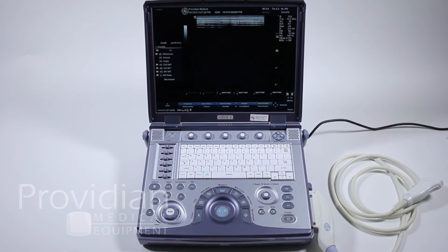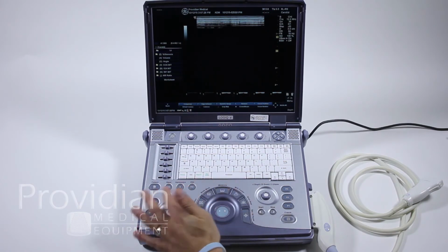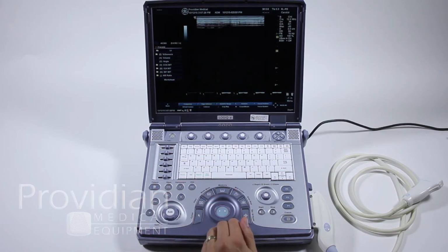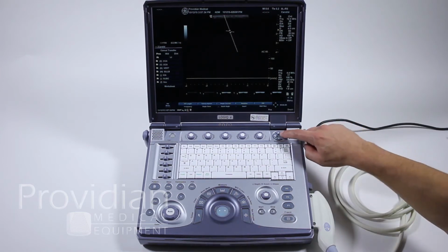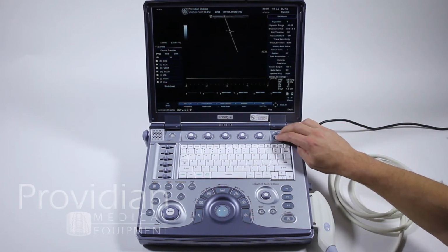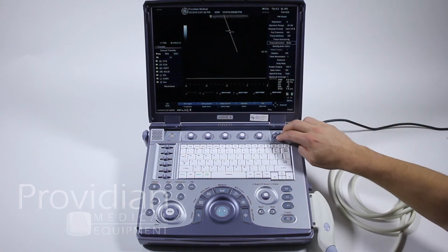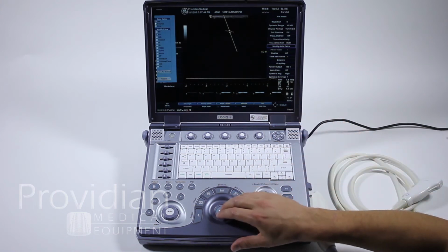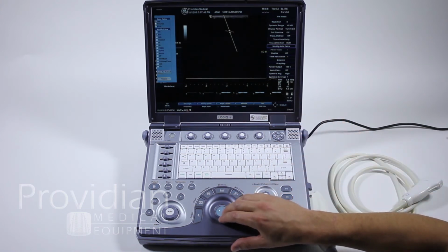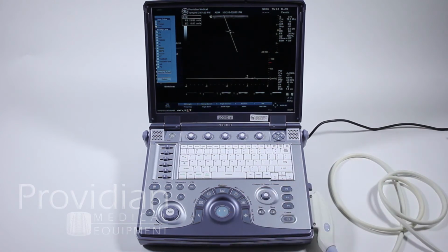In Doppler mode, there's an auto trace feature. So if I go to pulse wave Doppler, we'll need to use these paddles to activate that mode. So we'll go to modify auto calcs. And I'll push to the right and we can choose live or frozen or off. So live will show me, I'm going to go ahead and hit return.